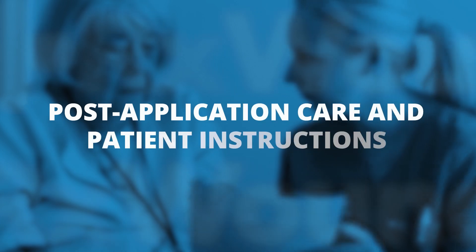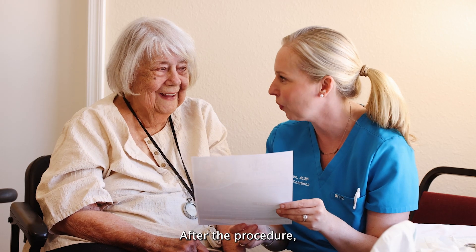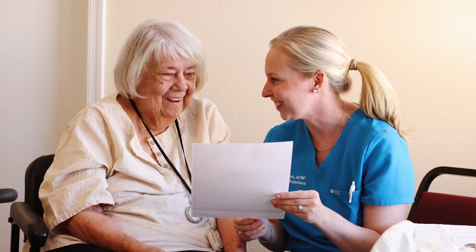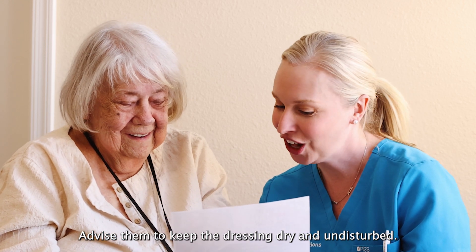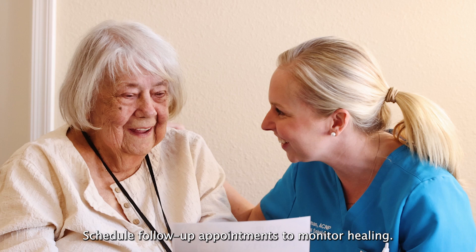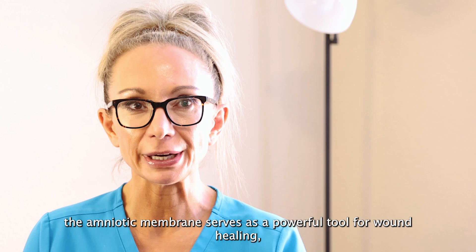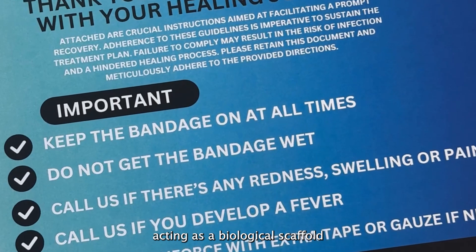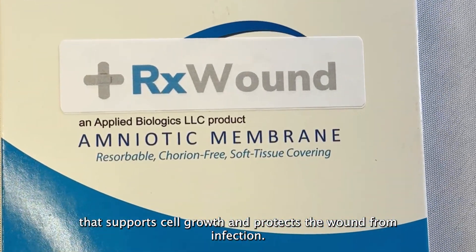Post-application care and patient instructions. After the procedure, provide the patient with clear instructions for home care. Advise them to keep the dressing dry and undisturbed. Schedule follow-up appointments to monitor healing. With proper debridement and application, the amniotic membrane serves as a powerful tool for wound healing, acting as a biological scaffold that supports cell growth and protects the wound from infection.